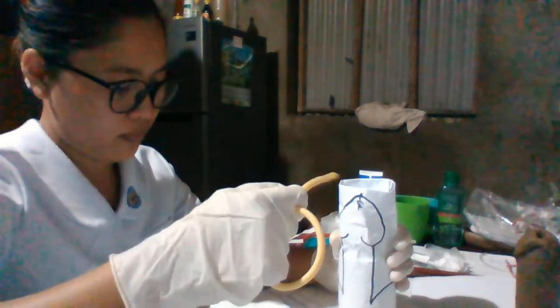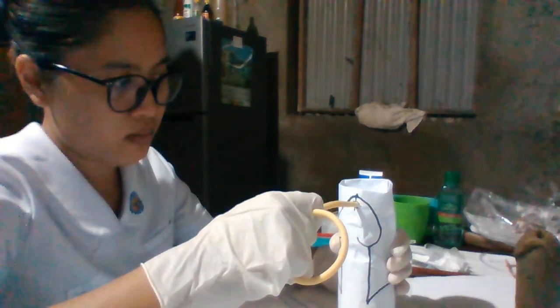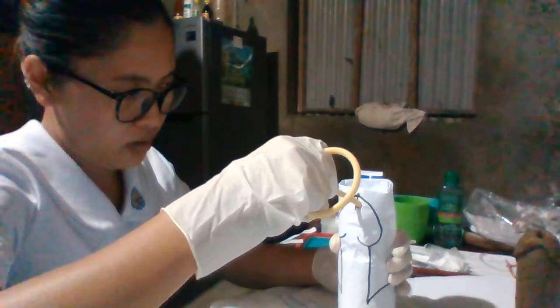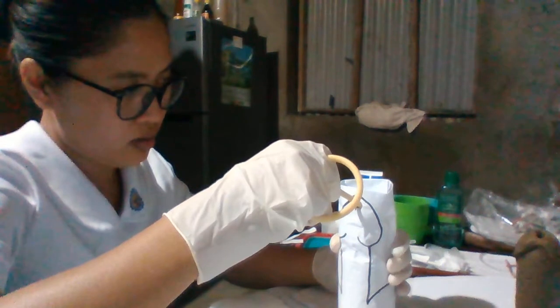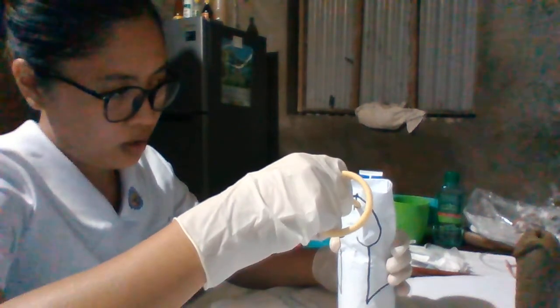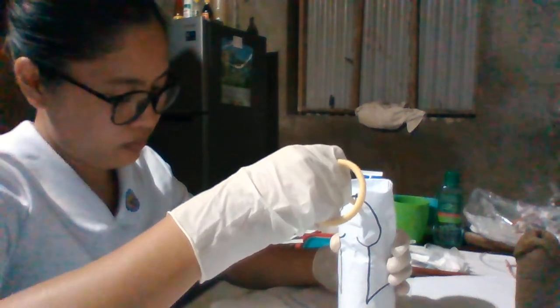Then we are going to slowly insert it. Next, advance the catheter 17.5 to 22.5 centimeter, 7 to 9 inches, for an adult. And for young people, it is 5 to 7.5 centimeter, or 2 to 3 inches.